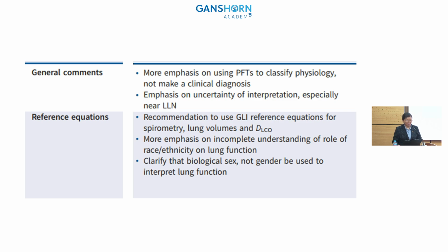lower limit of normal. For the reference equations, I think it is very important that we now use the GLI, the Global Lung Function Initiative reference equations for spirometry, lung volumes and also for DLCO. So in Vietnam, we have to change to the GLI reference with the Southeast Asian. Please take care of this very important part.